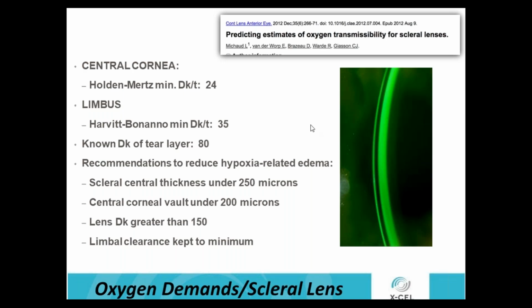A lot of times at the lab, if we don't get a material preference from the practitioner, we'll start them out in that 100 DK material and then work from there. Once you do go up to that hyper DK, so an XO2 or an Extreme, you do lose a little bit of that durability. So it can go back to the patient.